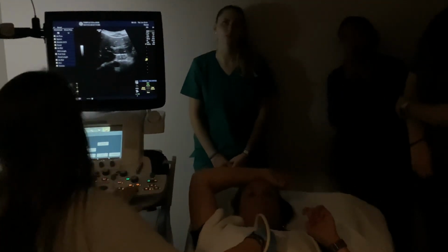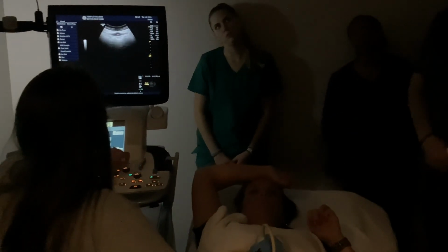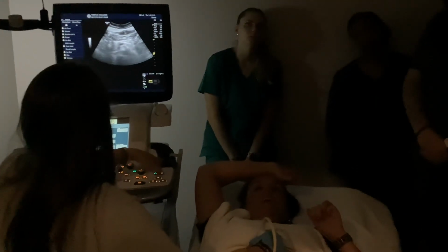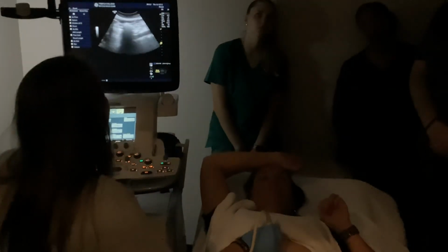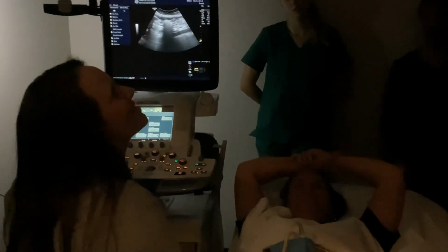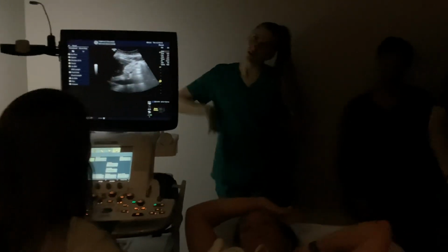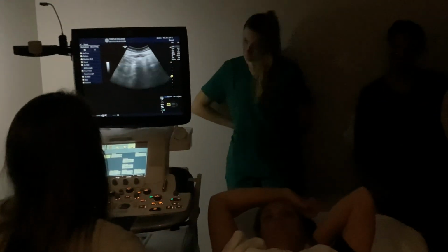What I don't see is the SMA because that is the mid landmark. Did you just get super gassy all of a sudden? Because I can't see your mid anymore. Oh no. And this is a lesson in moving quickly because you never know when things can change. And y'all will notice from taking in deep breaths, by your second hour, you're going to be a little bit gassier. So I'm going to show you her SMA landmark.